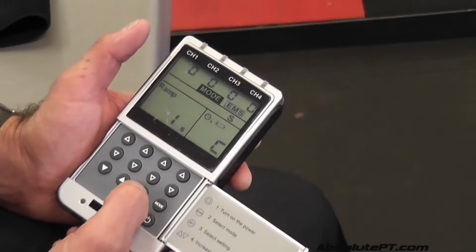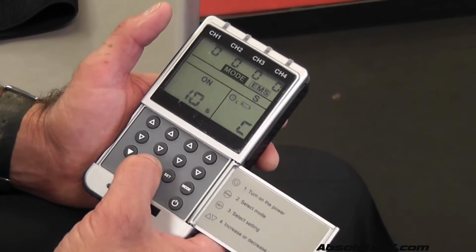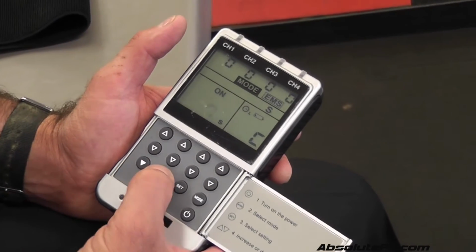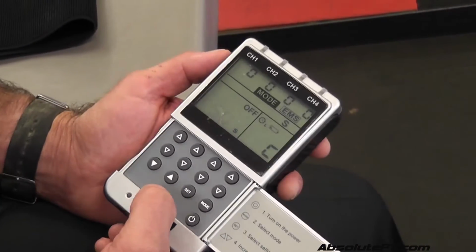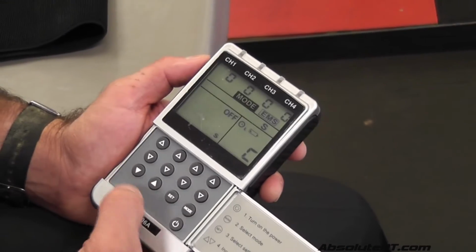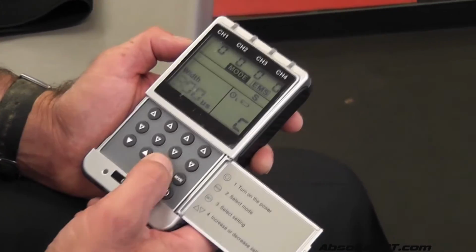Ramp I want to be 1 second. Then I go to how long I want my contraction to be. I want it to be 10 seconds. It's already there, but I go up more, down less. 10 seconds is my favorite. Okay, off time, 52, 53, whatever you want. I like 50, it's my favorite. Someday I may change my mind, but 50 is still my favorite.